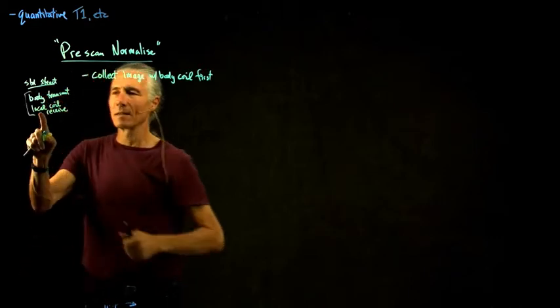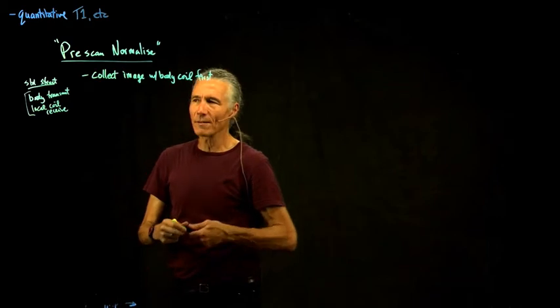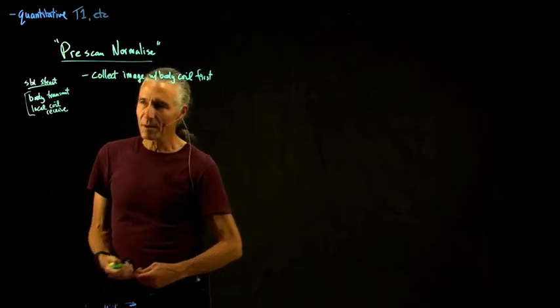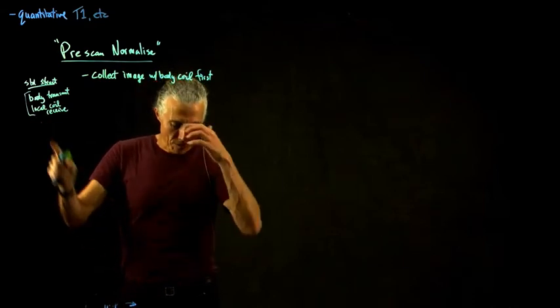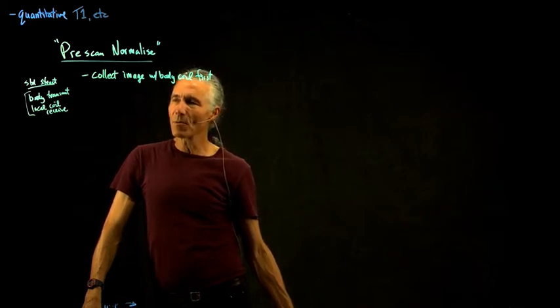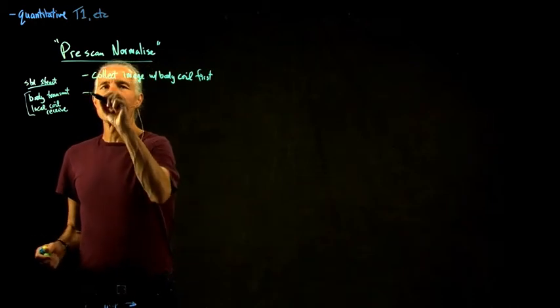So you would get that extra bright image on the receive side of the B1. But the transmit would be as uniform as it could be, though you'd still have some B1 transmit problem. But what if you just collect an image with the body coil? You wouldn't normally use that image, because the signal to noise is much lower than the local receive coils. But the body coil is far enough away from the head that it won't have the B1 receive problems, so the brightness of the image will be pretty much the same.